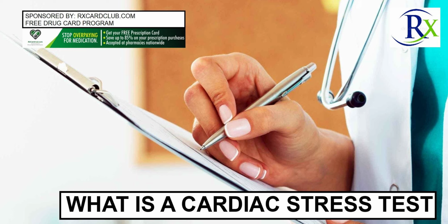Food and drinks. You will need to avoid eating or drinking anything with caffeine 24 hours prior to the test. This includes coffee, tea, energy drinks, chocolate, and certain energy bars. Only plain water should be consumed in the 4 hours before the test.